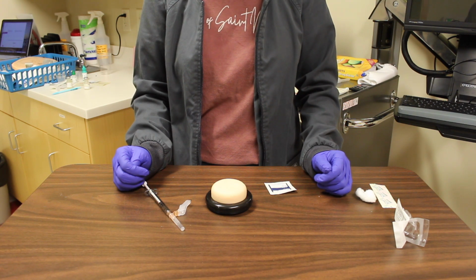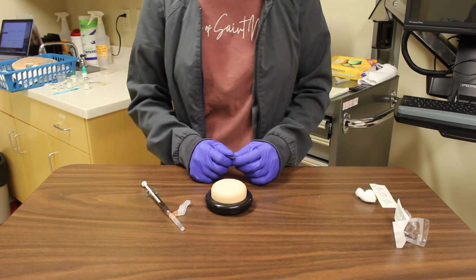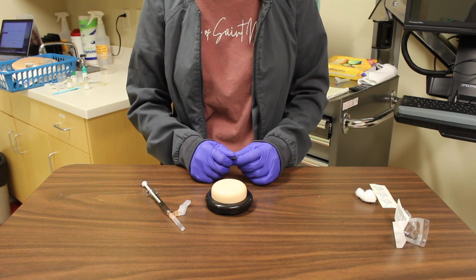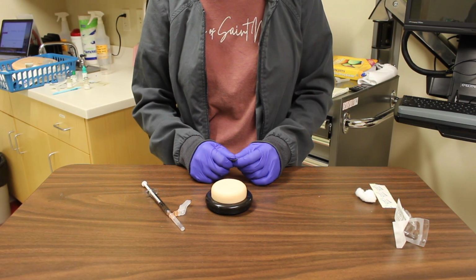Make sure you are rotating sites if they get subcutaneous injections regularly. For heparin, abdomen is the only site that will be used. Position the patient so the injection site is accessible and the patient can relax.